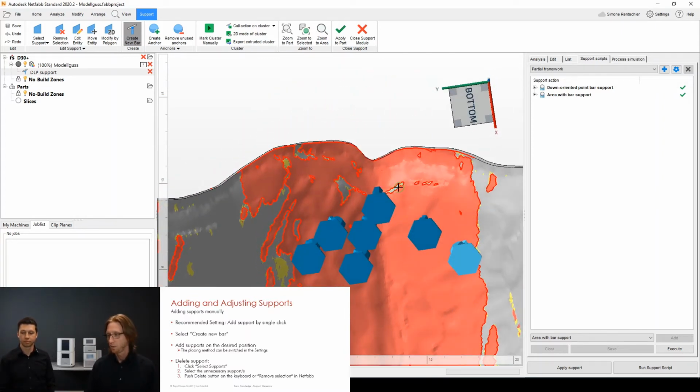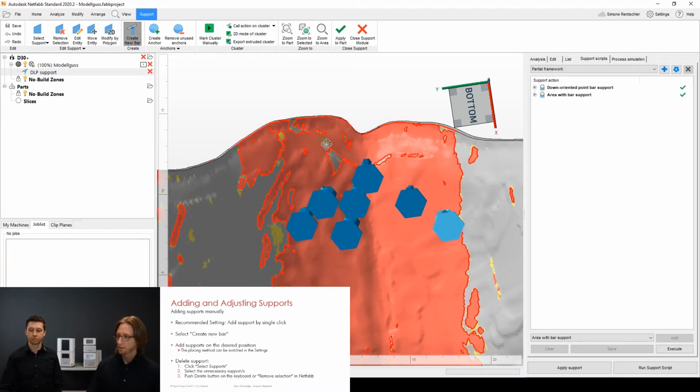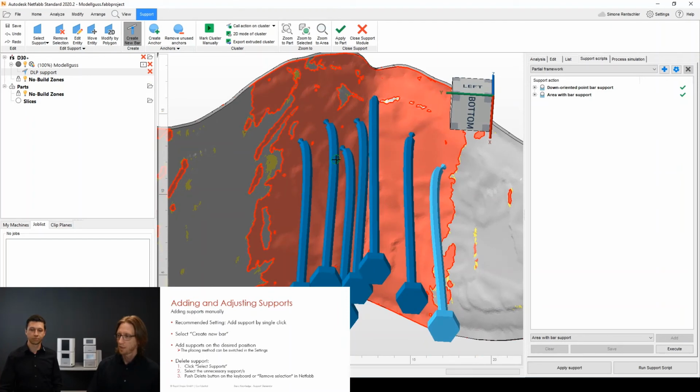So we would definitely recommend that you are working with this tool, with the single click. It makes life so much easier. Definitely. All right. So what we can see here now is that these support settings are a default version. You can see there's a breaking point. Also, we have a right angle between the part and the support itself. Maybe not the ideal solution, but it is a way to start.